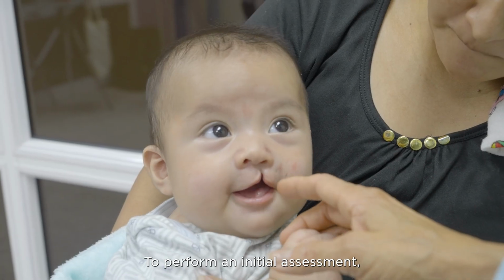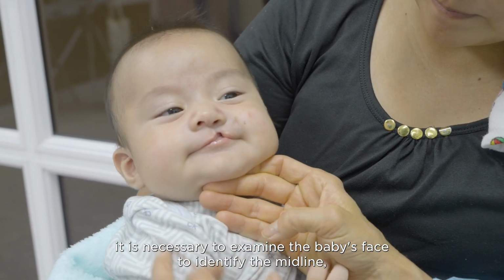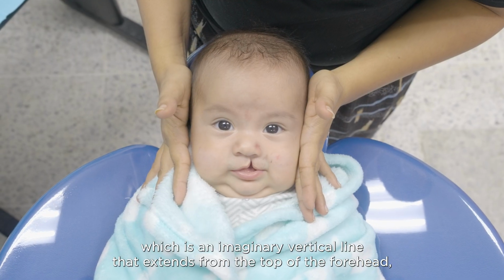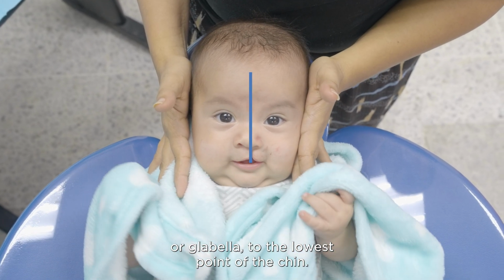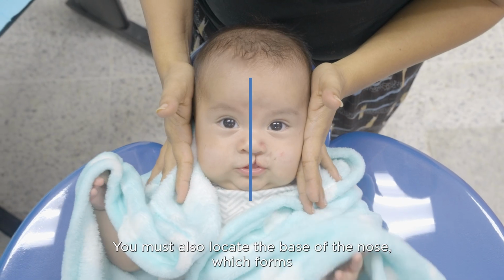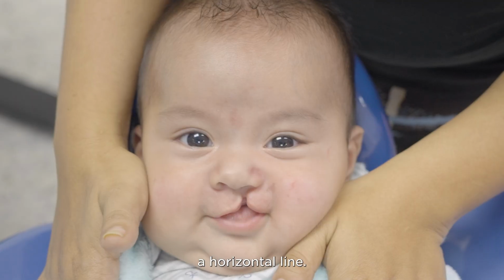To perform an initial assessment, it is necessary to examine the baby's face to identify the midline, which is an imaginary vertical line that extends from the top of the forehead, or glabella, to the lowest point of the chin. You must also locate the base of the nose, which forms a horizontal line.